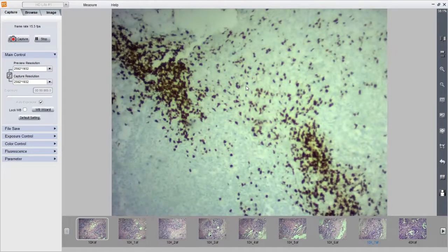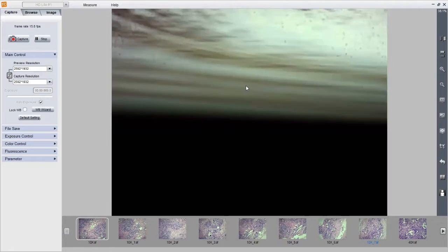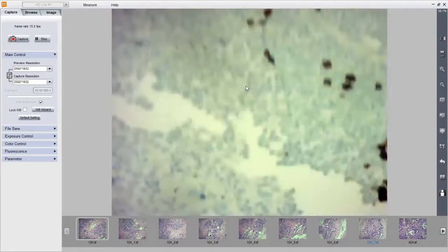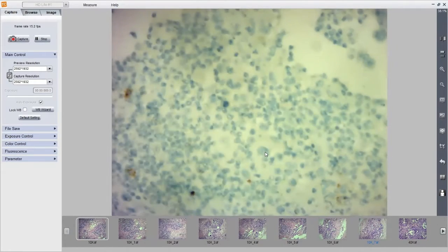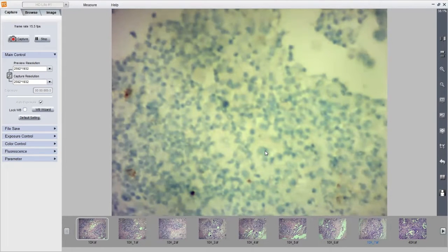Negative. Yeah. Can you see these large cells? Yeah. So always in lymphoma, as important as the positive staining is the negative staining. Your counterstain should be very bright and crisp so that you are able to understand the individual cells and see that these large cells are negative.